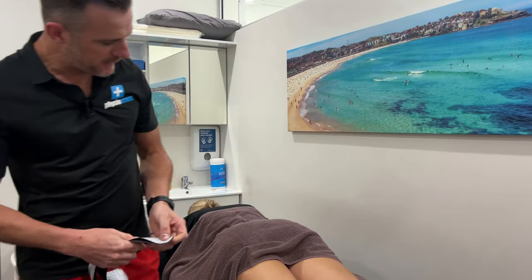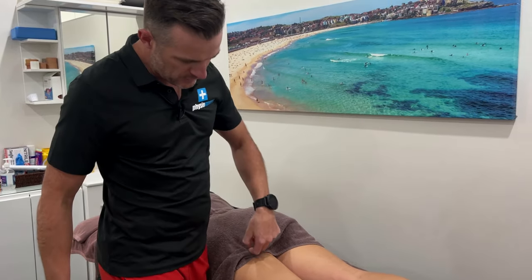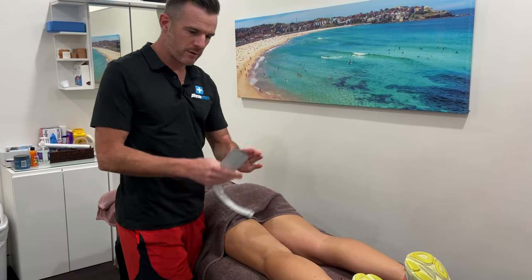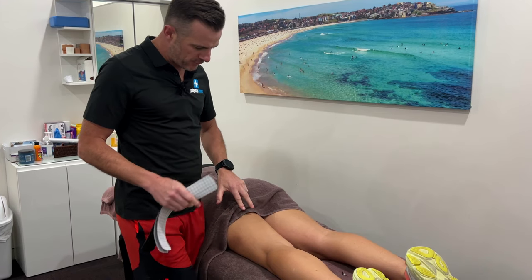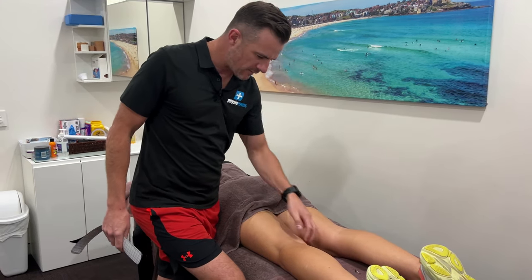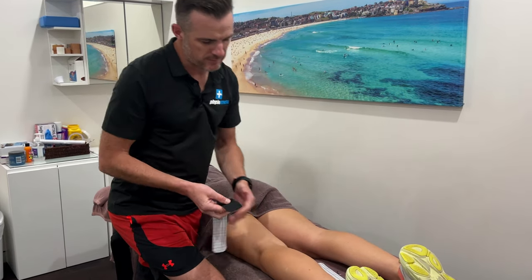One is going from the ischial tuberosity with the common origin to the lateral, and two are going medial — I would overlap those two, one sort of on top of the other because they're very close together. You can come down on their midline and then on the inside, and they sort of meet together. I don't really mind too much about that. So let's do the lateral one first.